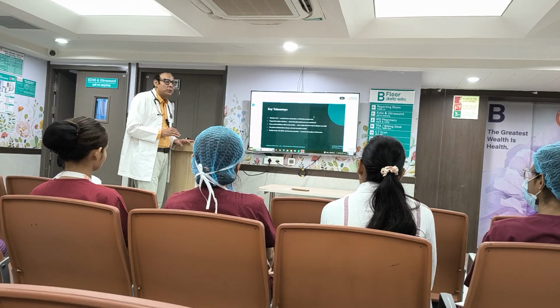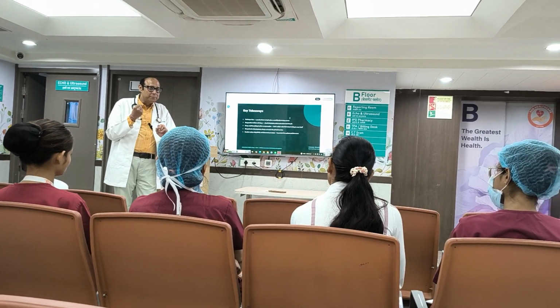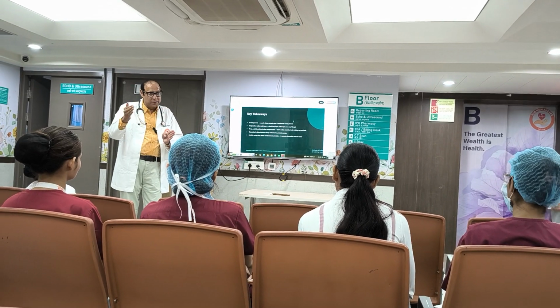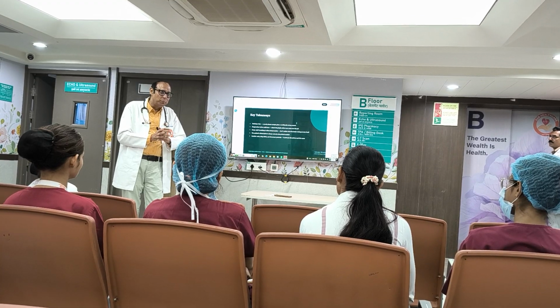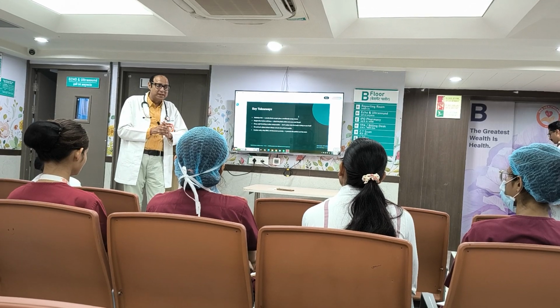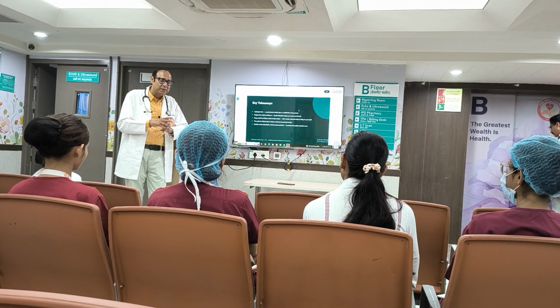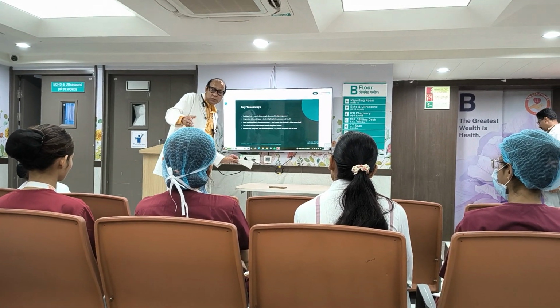So today we discussed the ABG: how to take the samples in the ward and ICU, and the lab procedure and logistic part. The sample should be kept in a cool place and handled in a correct manner. Don't let any oxygen inside, like air bubbles or anything. We also discussed the indications for when to go for ABG and why we are taking the components of the ABG.